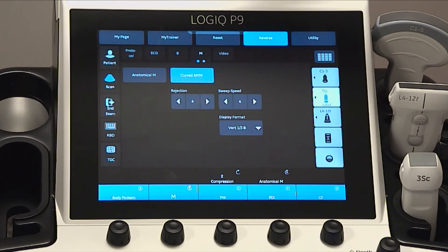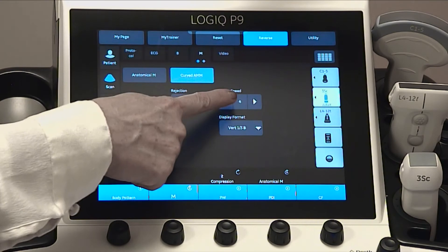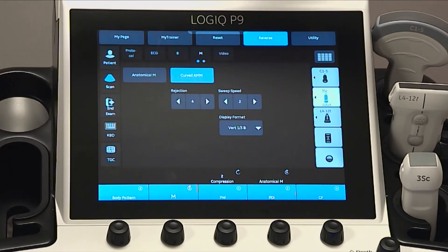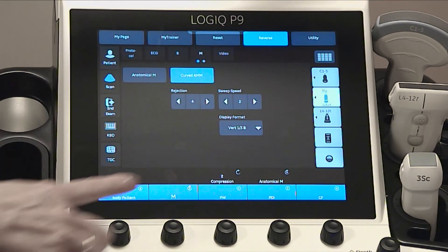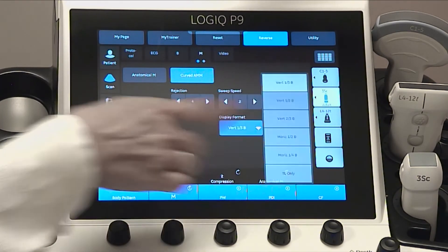Sweep speed changes the speed at which the timeline is moving. And display format changes the horizontal and vertical layout between M mode and timeline only.